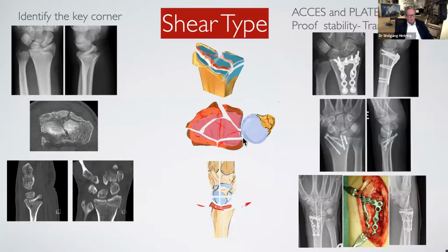They are sometimes really like swimming ice, and you have to go very wide distally, like with this frame plate, or do also fracture-specific screws inside with arthroscopic support. Or as you can see here also, when it is dislocated to the dorsal side, from the dorsal side with a frame plate and an accessory stabilization with two transfixing K-wires through the carpus.